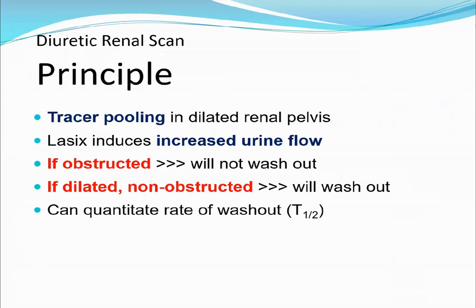We must keep in mind that T-half must be calculated in these studies, as T-half can assist diagnosis. What is T-half? T-half is the time needed for the kidney to wash out half of the quantity of counts taken by it, and normally it is 10 minutes or less. This is normal T-half. If it is more than 20 minutes, it is obstructed.